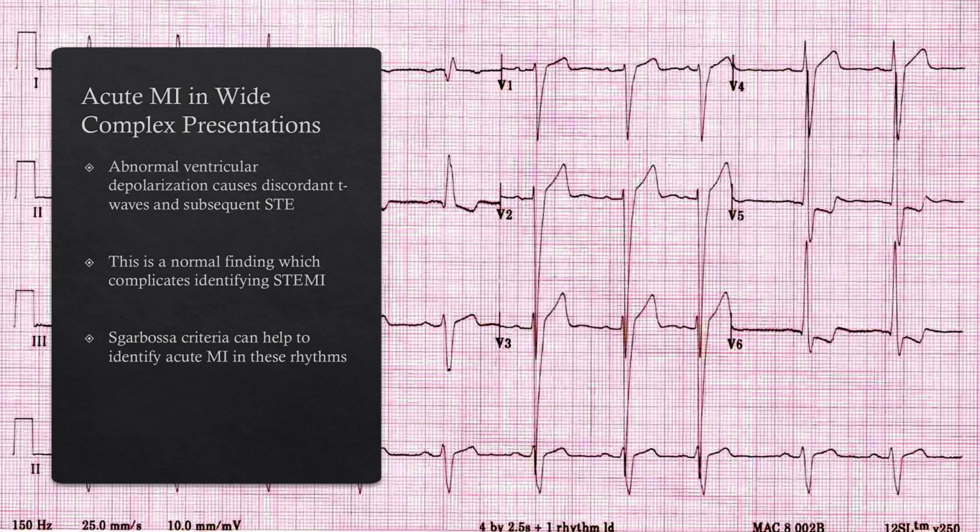So in a normal person, in most leads, your QRS and T waves are concordant, which is kind of counterintuitive because depolarization and repolarization of the myocardium represent opposing charges, right? The depolarization is overtly positive, and then repolarization by default is going to be the opposite charge because you're repolarizing. So really, T waves and QRSs should be discordant in pretty much all cases, yet that's not what we find.